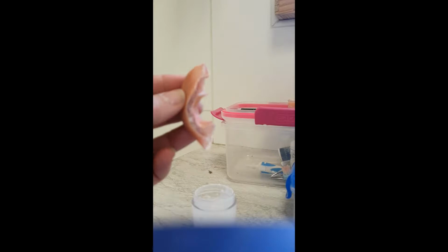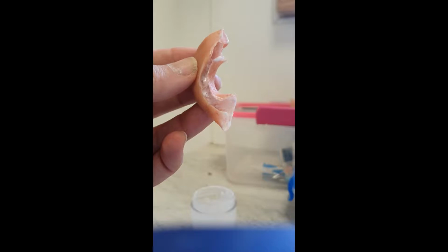Now this can't stick. I cannot now stick this to my ear. This must now first set a bit. So if I bring it closer, it needs to set and it needs to go close to see-through. So this can take quite a while. So I'm going to just put it down here.